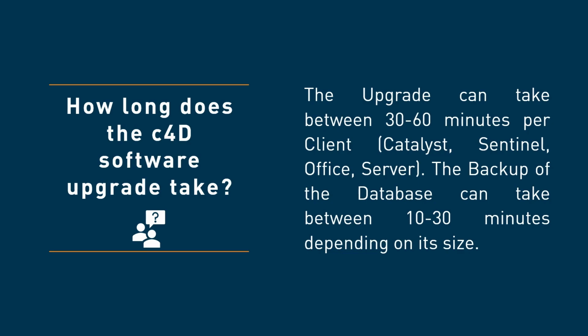How long does the upgrade take? Usually the upgrades for the Catalyst and Sentinel clients are quite fast and should be done in less than 2 minutes. However, there are also tests to be performed after the upgrade, which is why the whole upgrade can take up to 60 minutes per client. And depending on the size of the c4D database, the backup can also take longer, but usually not more than 30 minutes.